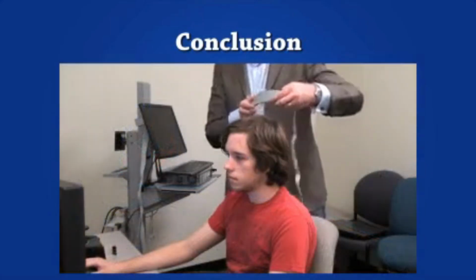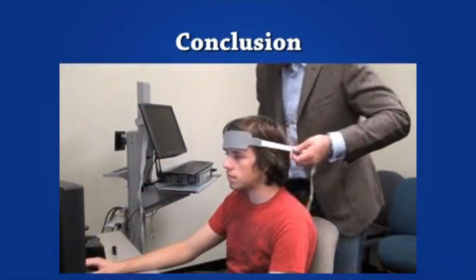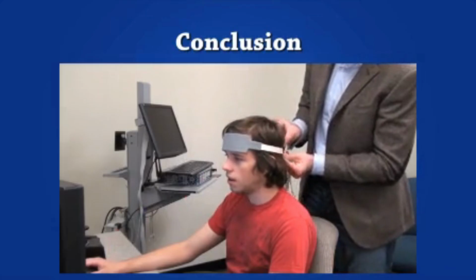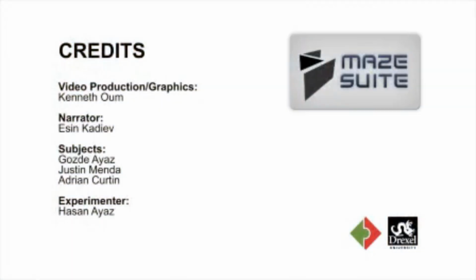fNIR is a portable, safe, and non-invasive brain monitoring tool that has been used in clinical, laboratory, and natural settings to study brain activation. We hope this presentation was helpful in explaining these tools. Good luck with your experiments.